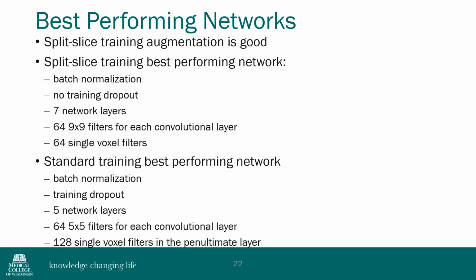Optimal networks are shown on this slide. Differences in training yield significant differences in optimal network hyperparameters. While this work uses the de facto standard HCP acquisition, it is expected that network hyperparameters should be individually considered for studies using other acquisition techniques.